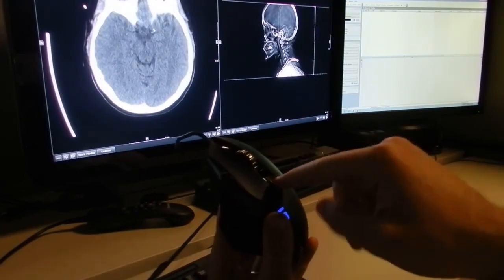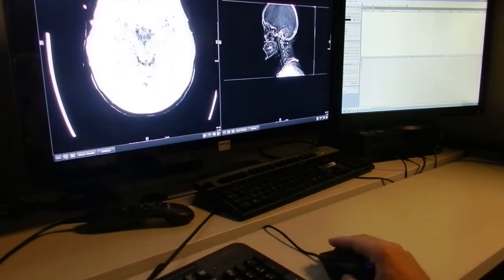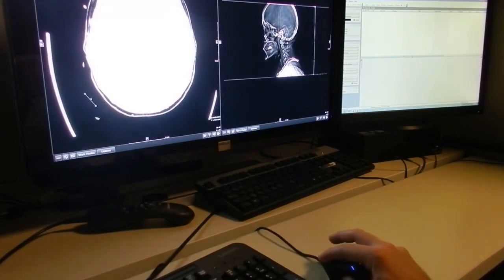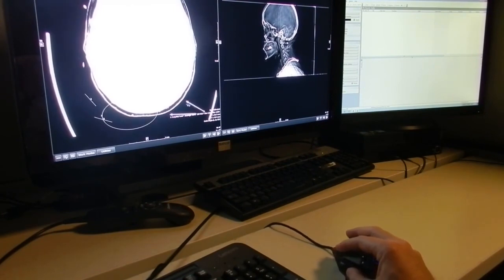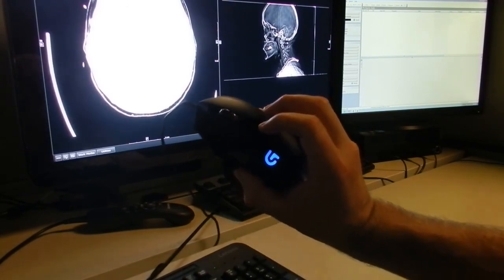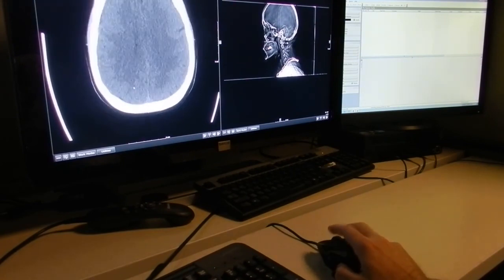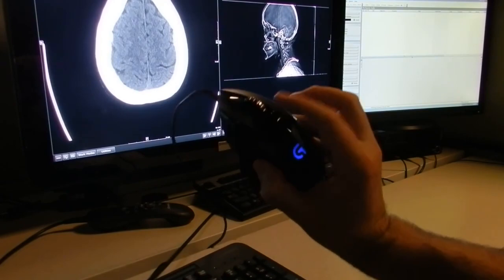Right behind that is the reset tool. Let's say you messed up the windowing of your study, and then you put all sorts of measurements and ROIs over it, and you don't like the way it looks because there's just way too many arrows. You can just hit that reset button and everything goes to the last saved version of the study. So, reset tool, break.